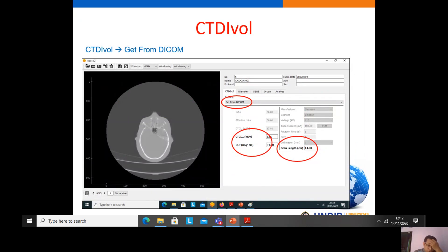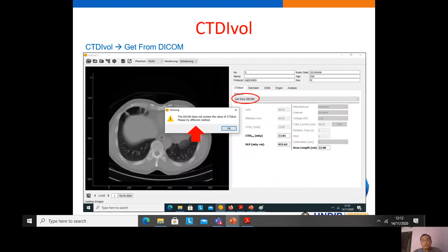The second method to obtain the CTDIvol is from the DICOM info. We choose the option 'get from DICOM info' and automatically obtain the CTDIvol and DLP. However, not all CT images store CTDIvol info in the DICOM. If our images don't contain CTDIvol, the software will give a warning, and we can try another method.